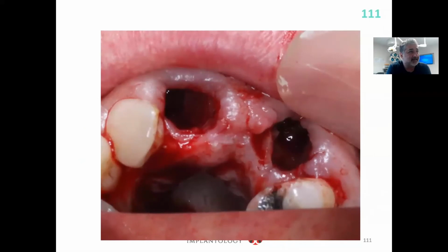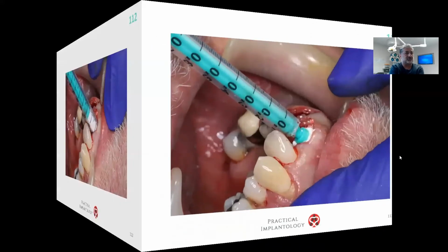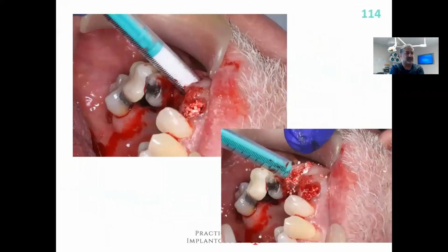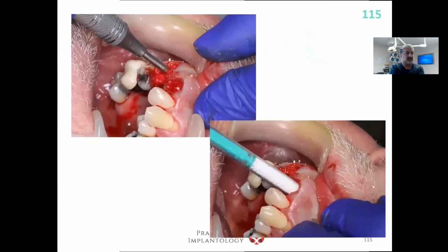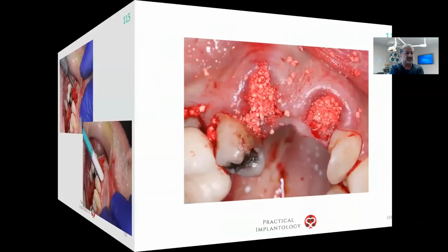Then I will take the cotton rolls out, and I will wash with saline in those sockets. Okay, I then took my mix, which was ready from the start, and again, as I said, it's surgiplaster and beta tricalcium phosphate in this case, and I would push it right into the socket, filling the socket out as much as I can. And I would push a plugger into the socket and really fill that socket up.